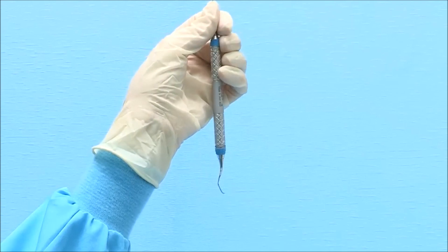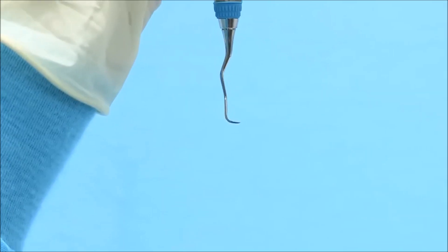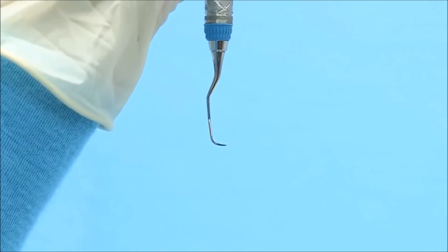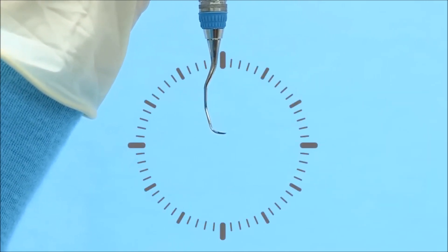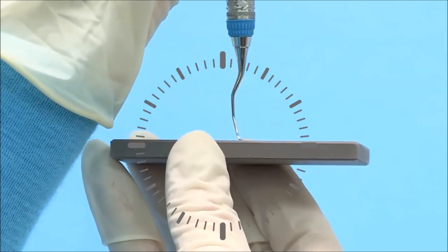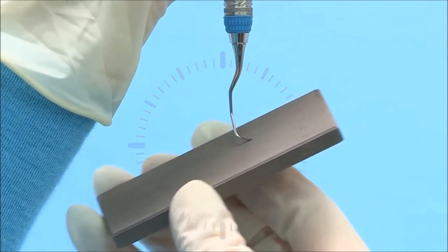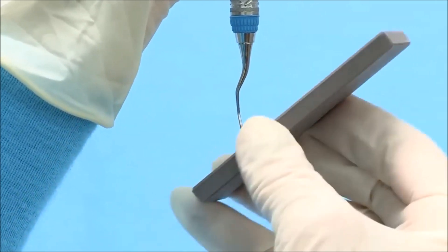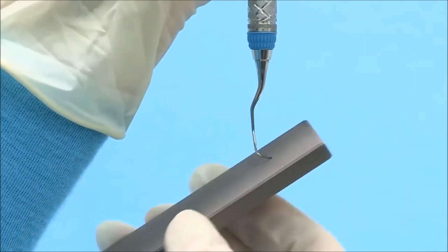When rounding the toe of the even-numbered Gracie Curette, rotate the instrument so that the toe is pointed at 3 o'clock. The face of the instrument should be parallel to the table surface. Position the stone underneath the blade at 3 o'clock and tilt the stone upward to the 2 o'clock position. Move the stone in a consistent motion overlapping the strokes and rotating around the toe to maintain the rounded shape.